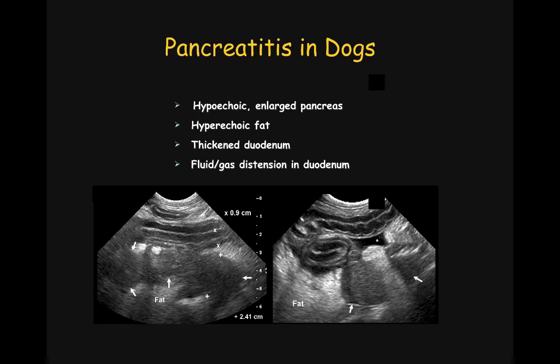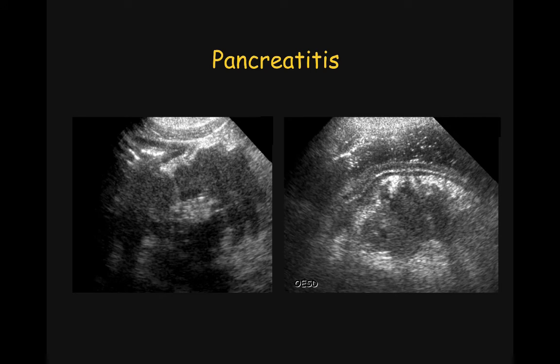This dog has several distinct useful features that assist in diagnosing this disease. The pancreas is usually thickened — in this dog, it's up to 2.4 cm — and is hypoechoic in the affected region. The fat saponification results in an increase in echogenicity of the fat, contributing to outlining the inflamed pancreas even better. In some instances, anechoic abdominal effusion can be seen, resulting from regional peritonitis and vasculitis. Functional ileus of the stomach and duodenum may be seen as static fluid or gas accumulation, and in this Old English Sheepdog, the duodenum seen in longitudinal section contains a moderate amount of fluid with no evidence of peristaltic activity in real time.